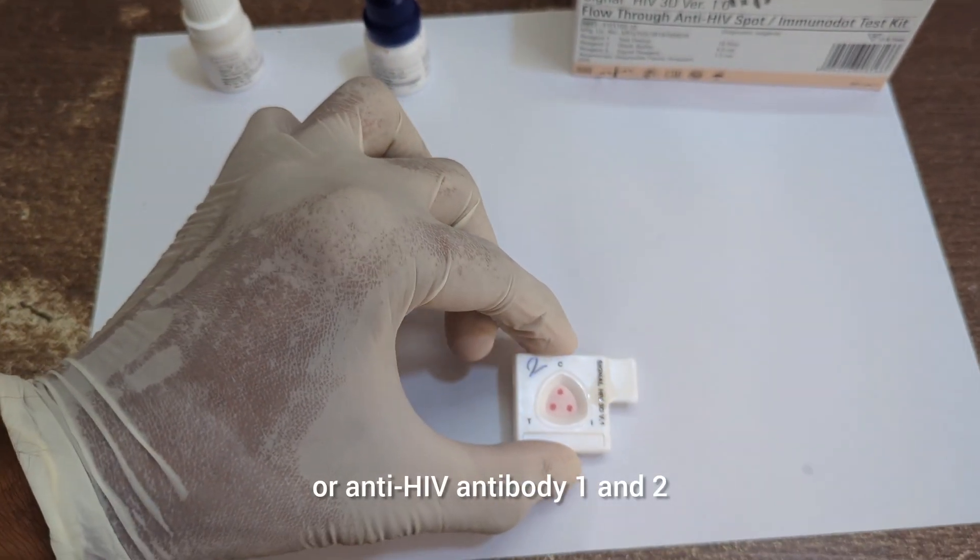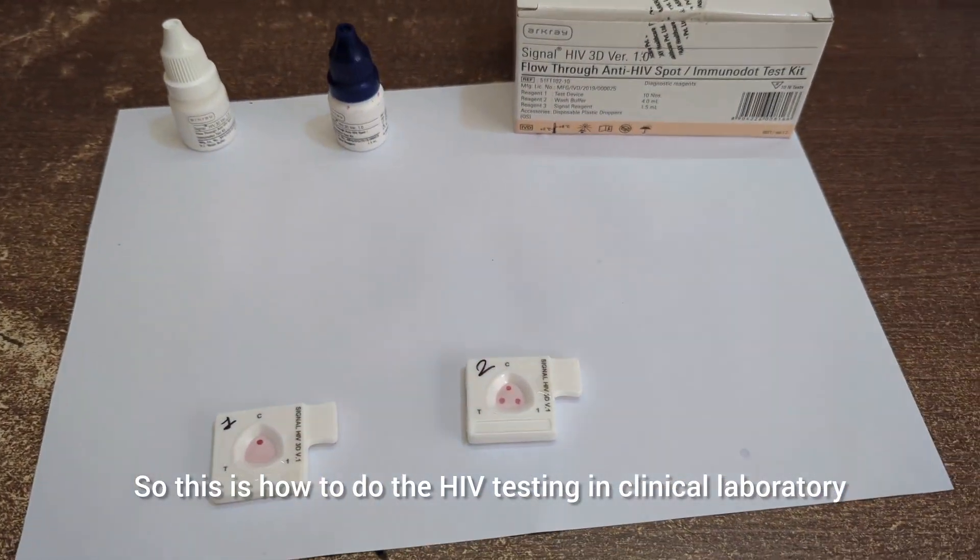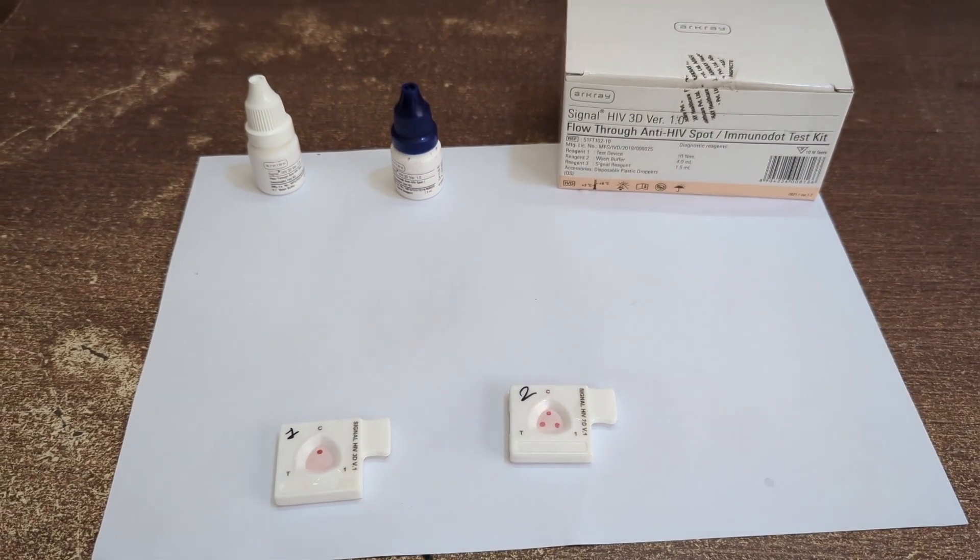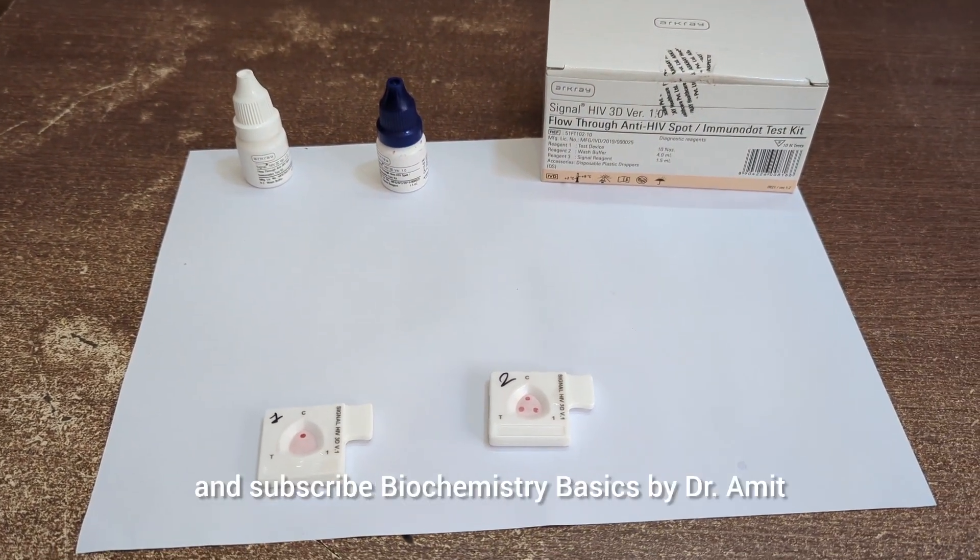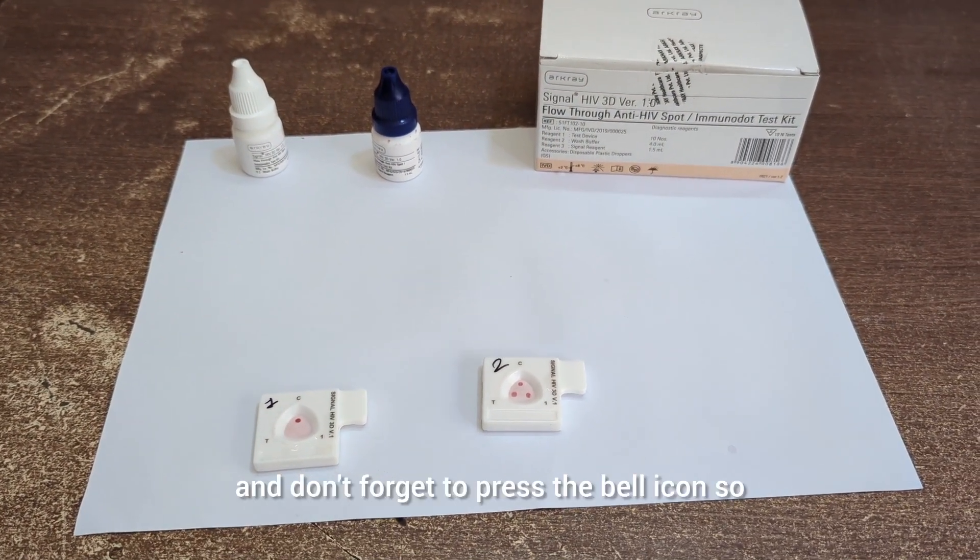While in test kit number two, you can see there are three dots: one at the C, one at the T, and one at the number one. So this sample is positive for HIV, positive for anti-HIV antibody.